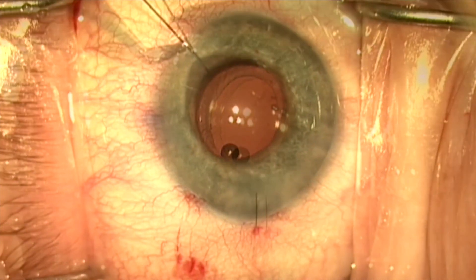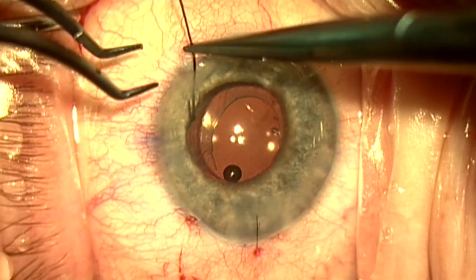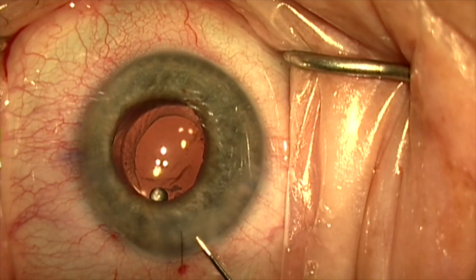We create a physiologic pressure within the anterior chamber and the case is completed. Thank you for your attention.